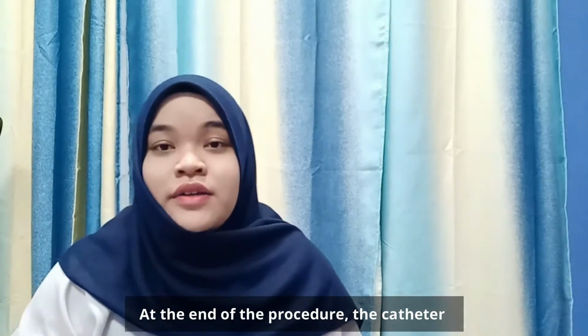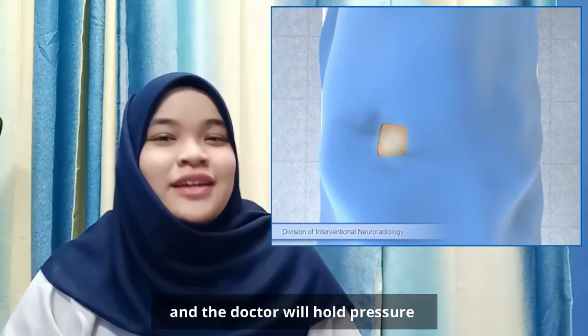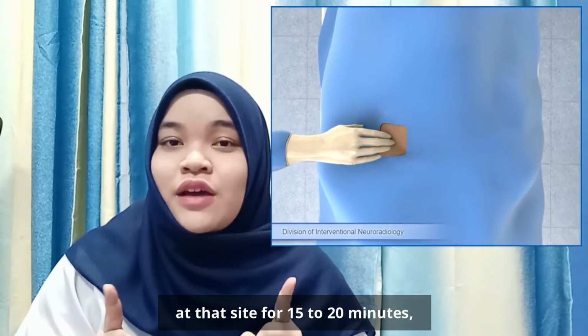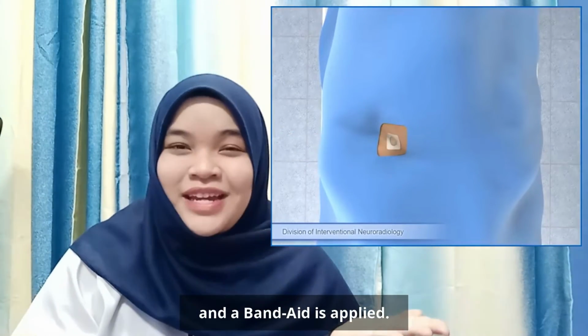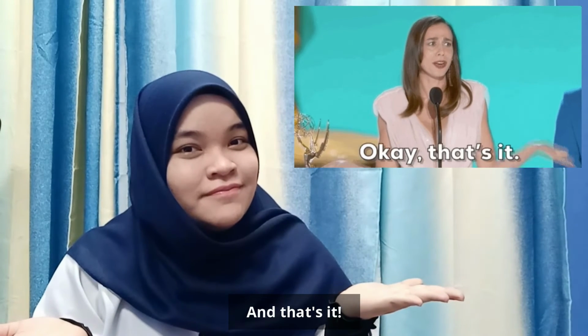At the end of the procedure, the catheter is removed from the groin, and the doctor will hold pressure at that site for 15 to 20 minutes, and a bandage is applied. And that's it.